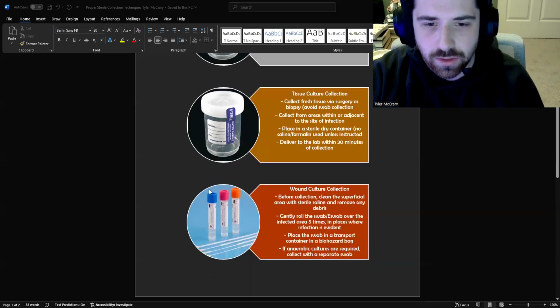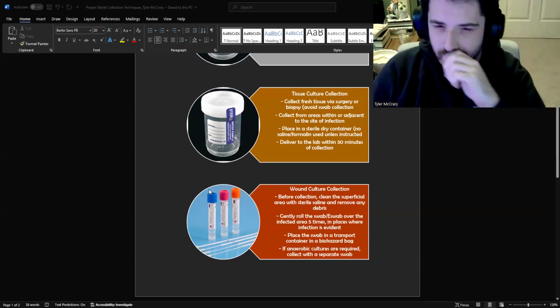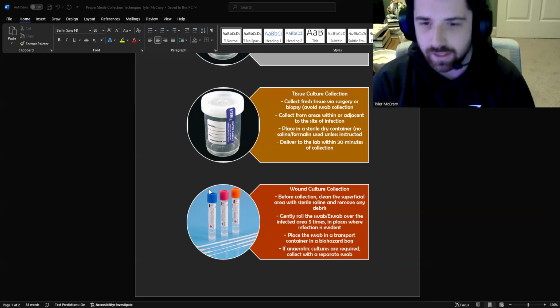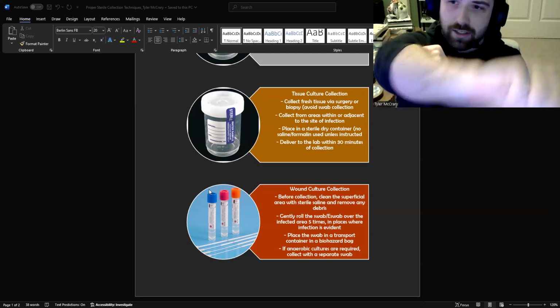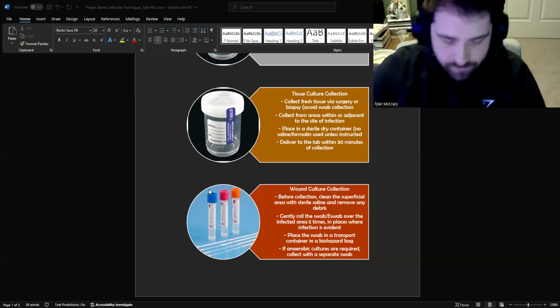So for wound culture collection, that's where you can use more or different methods to do it. Before collection, you want to clean the superficial area with sterile saline and remove any debris. So let's say, for example, we're collecting a site from my arm.